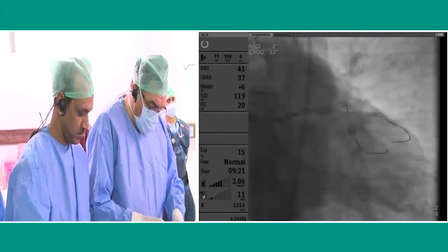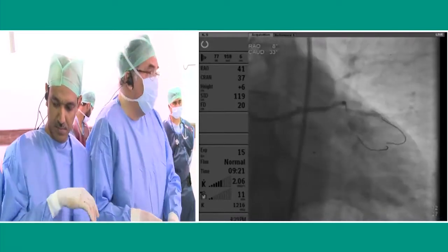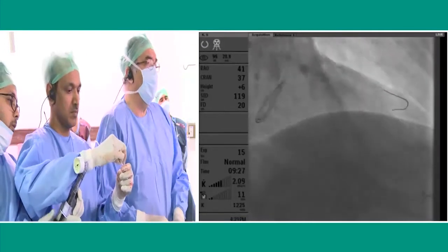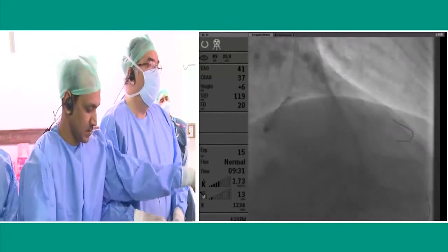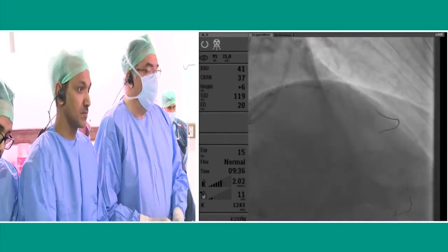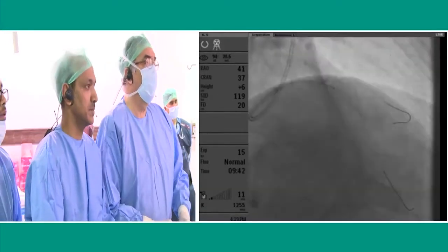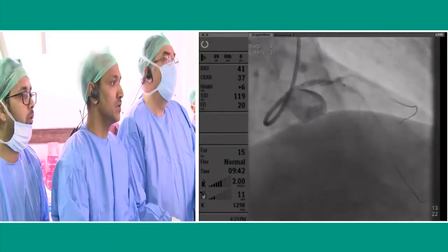We will see. So here we are in the LAD. This is a stent, center, table 3, please. Okay, here. Can we make a shield, the filter on the side? Thank you. So this is a stent. I think it's enough. We can remove the wire a little bit. It's too distal in the LAD. Test. Go on. I think it's not too bad here. Go on.